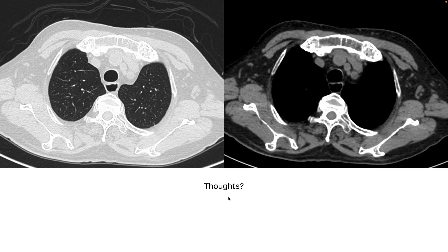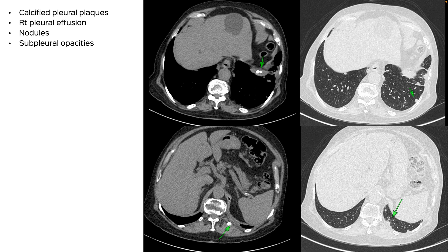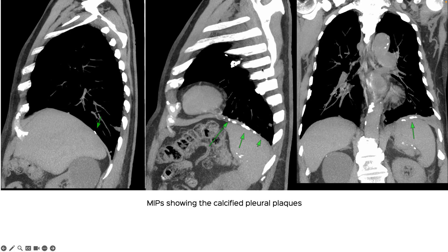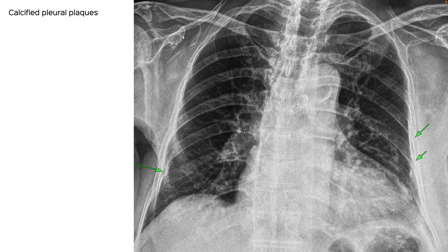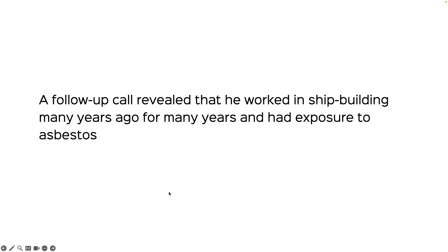What we have are calcified pleural plaques, lung nodules, some sub-pleural opacities, and a right pleural effusion. The key finding to pick up is the pleural plaques, which are bilateral and seen extremely well here. We need to find the cause — these kinds of pleural plaques can occur because of old infection, trauma, or the classic asbestos exposure, and you can see them on the radiograph as well.